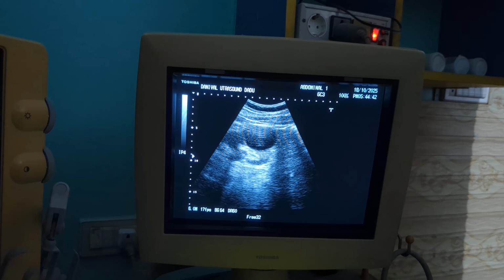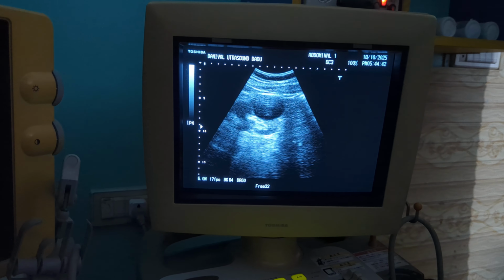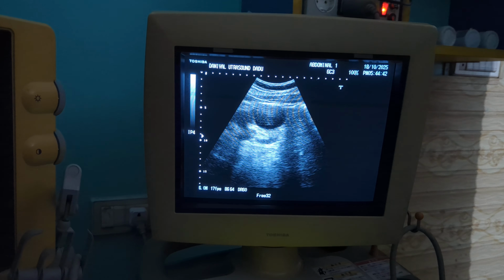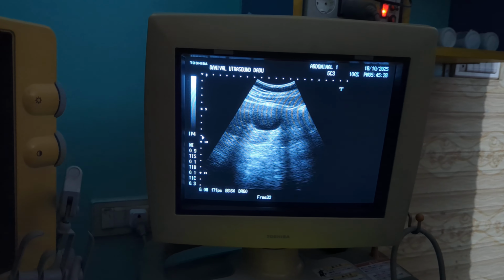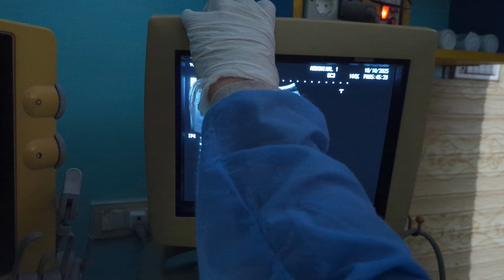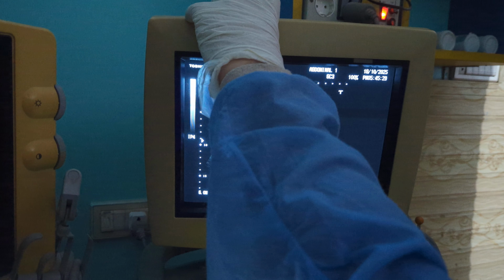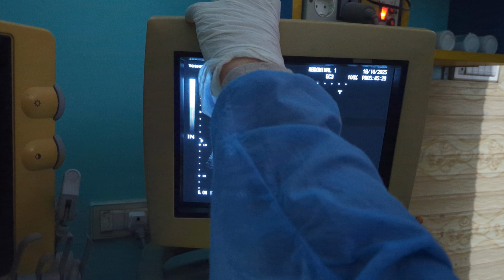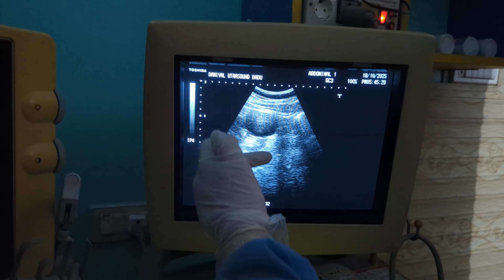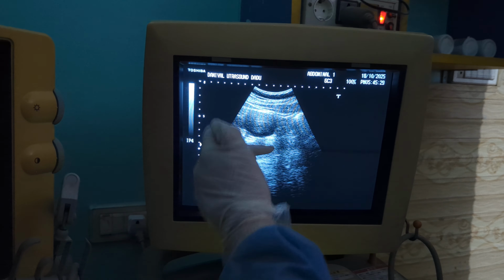So now come to the cysts. They are completely anechoic, like I told you, with a posterior acoustic enhancement. What is enhancement? When we throw waves right at the top of the cystic mass, they just cross the fluid and are quite visible at the inferior part.